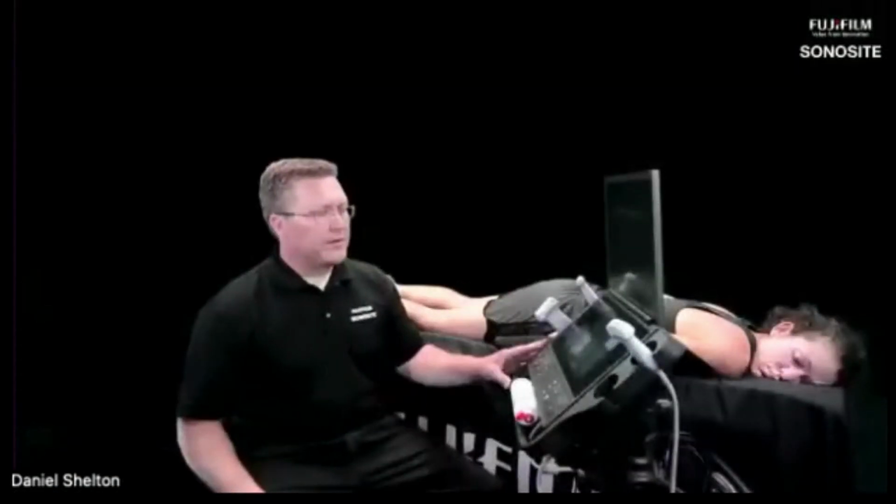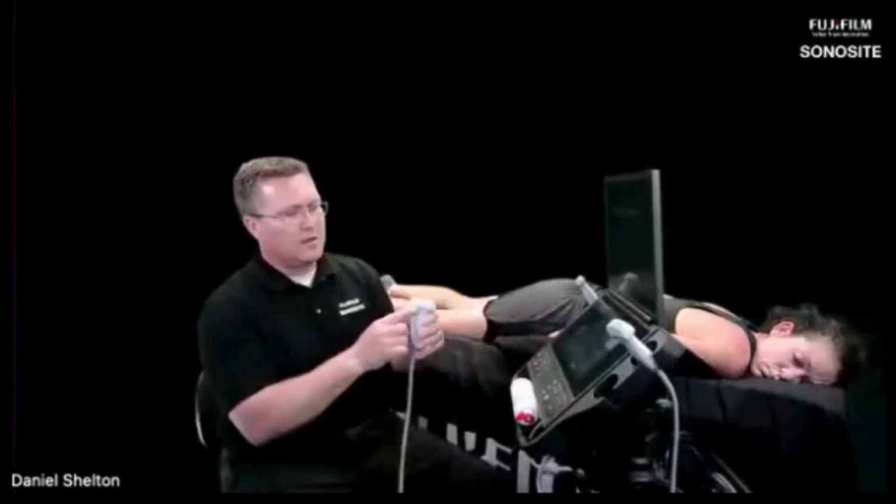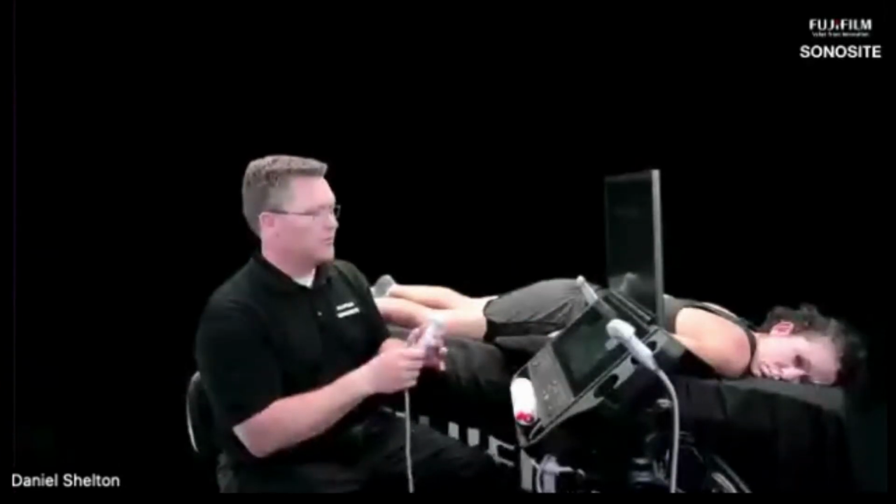So now we will switch to the live demo. So today we're going to be scanning with the Sonosite PX. I'll be using the L15 to 4 transducer.